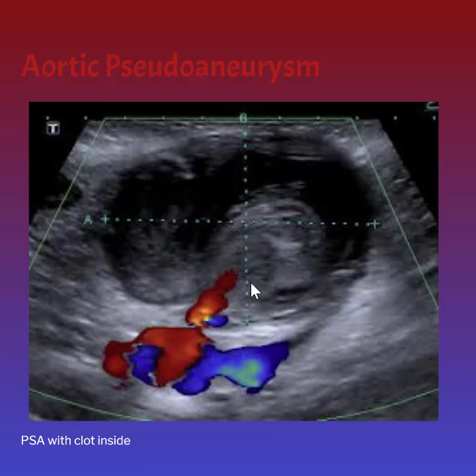When we use that pressure, we literally are just standing, putting pressure on the patient's leg with the transducer, with our bodies, holding this neck closed as much as possible. It's actually pretty painful for the patient, and it's kind of painful for the tech. So oftentimes, if we can, we try to double up on these. One tech can do it for 5 minutes, and another tech can do it for another 5 minutes. Once we hold that pressure for those 10 minutes or so, we double check to see if there's continued flow into the aneurysm.